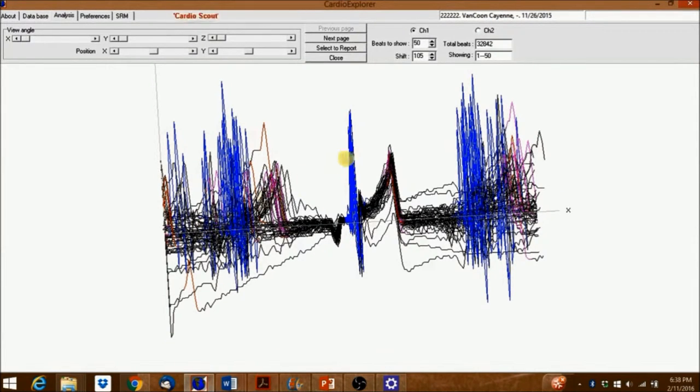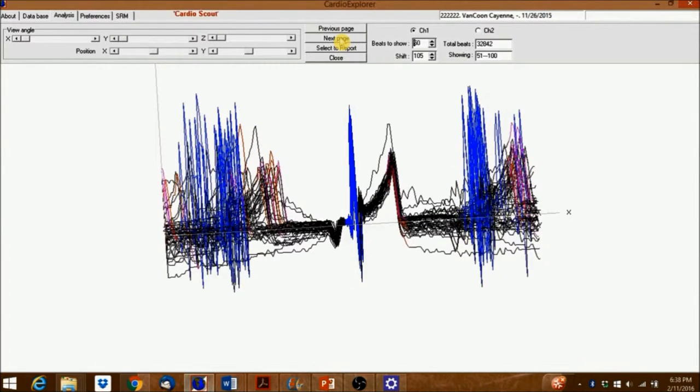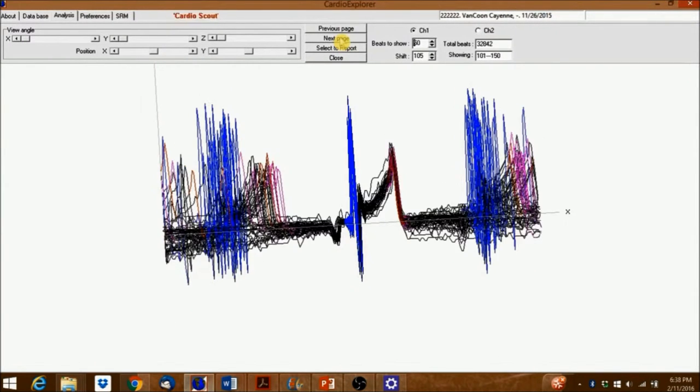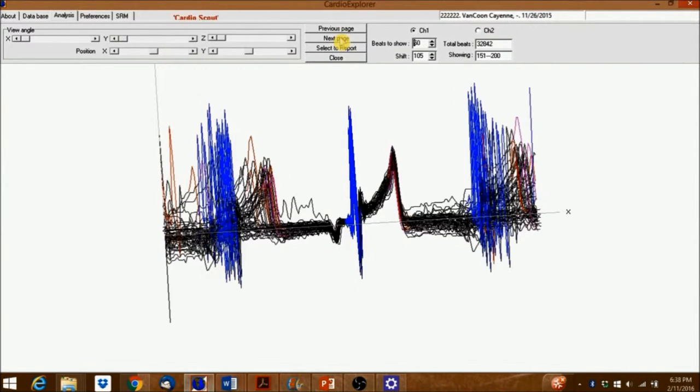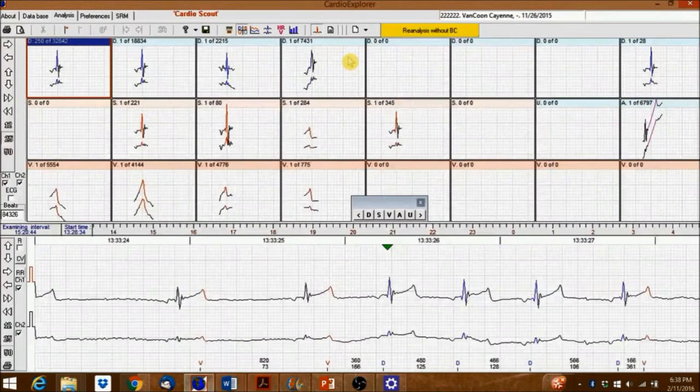If needed, click on Next Page to jump to the next selection until all beats have been inspected. Click Close to return to the previous window.